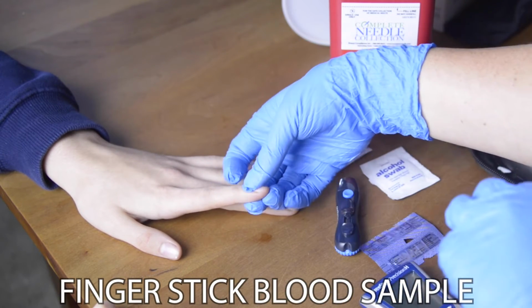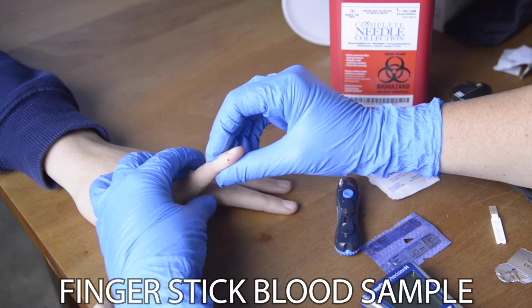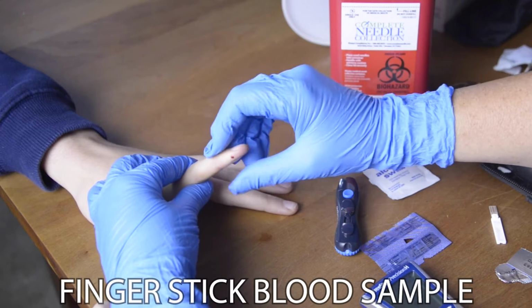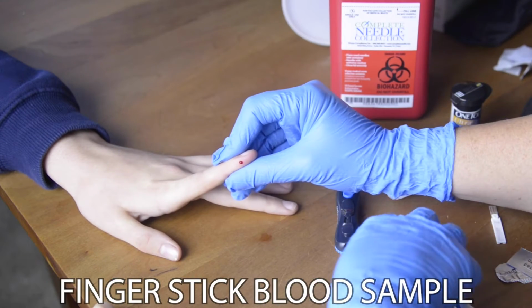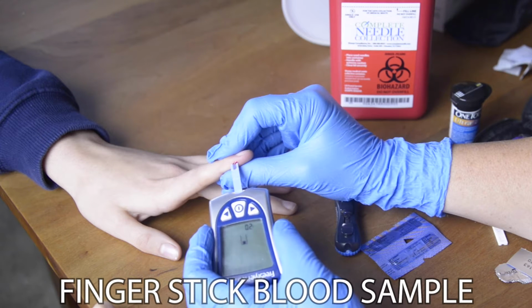That will generally allow us to express a good drop of blood. Now you'll need a reasonable amount of blood to take a sample. And so if your patient's hands are cold or they're otherwise not bleeding, you want to make sure that you've got enough of a blood drop to fill the test strip of your meter all the way up to the top.